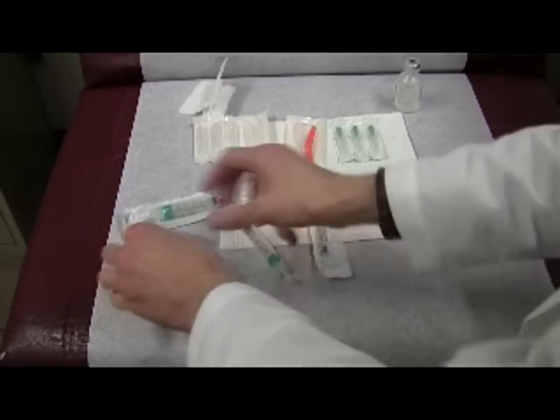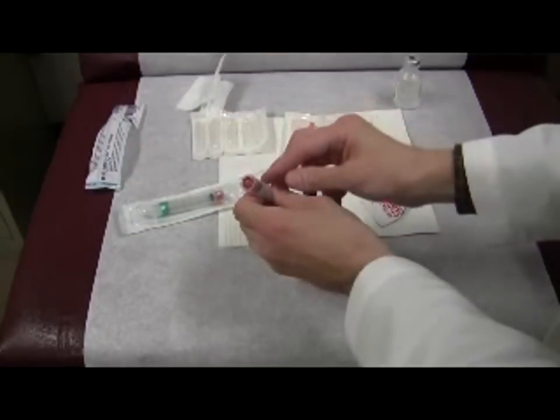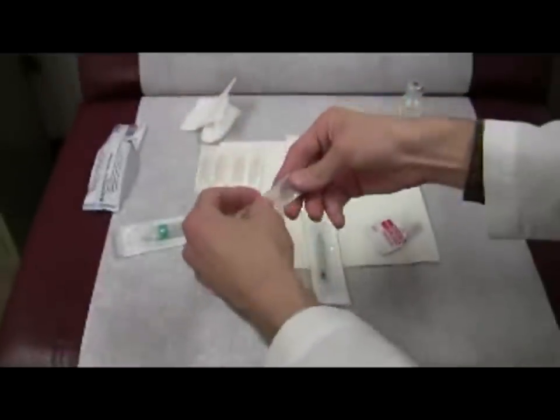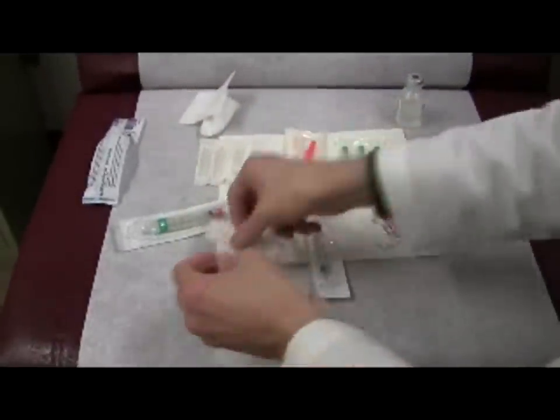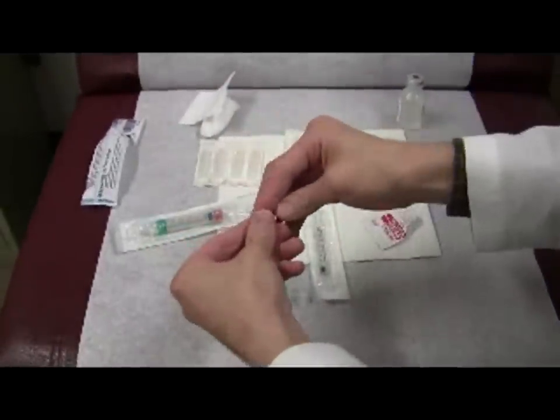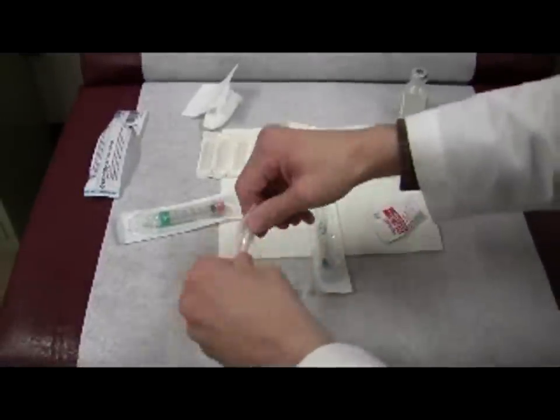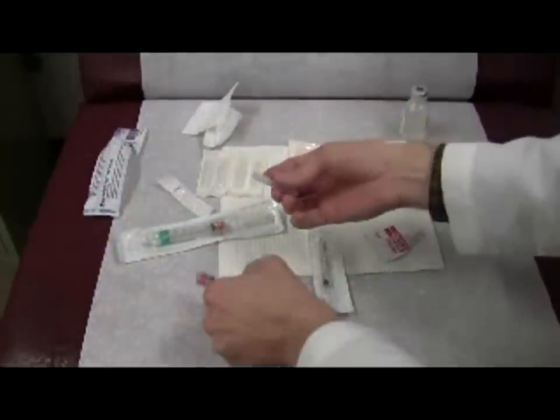For a syringe with a Luer-Lok, when placing a needle on the syringe, be sure that first the cap is snapped tightly on the needle, because sometimes they come loose from the manufacturer. You can pull it, or I just frequently do that if I don't need a sterile technique.